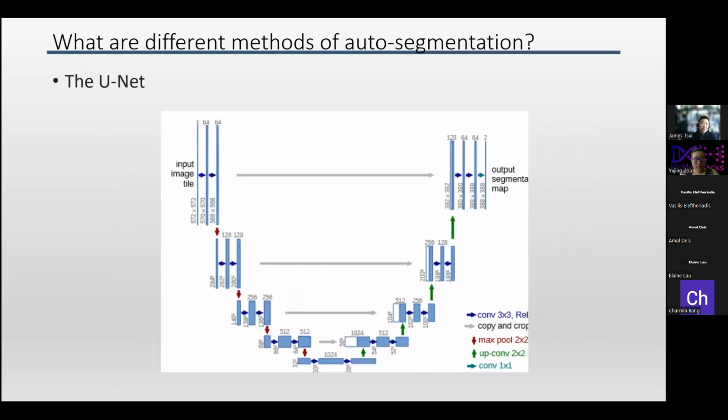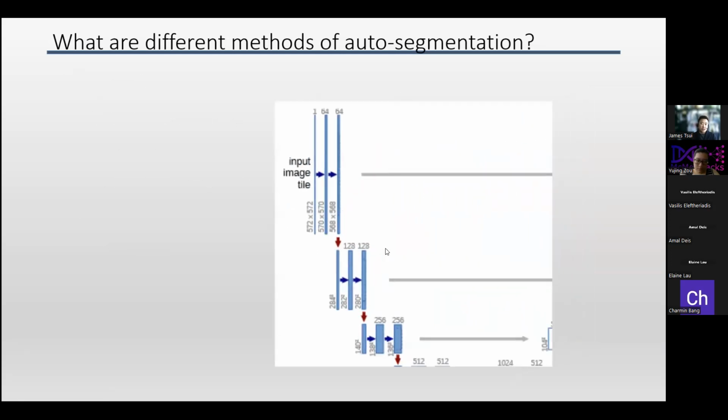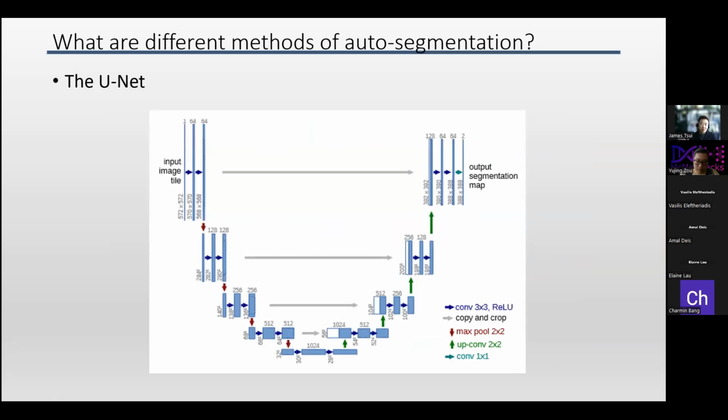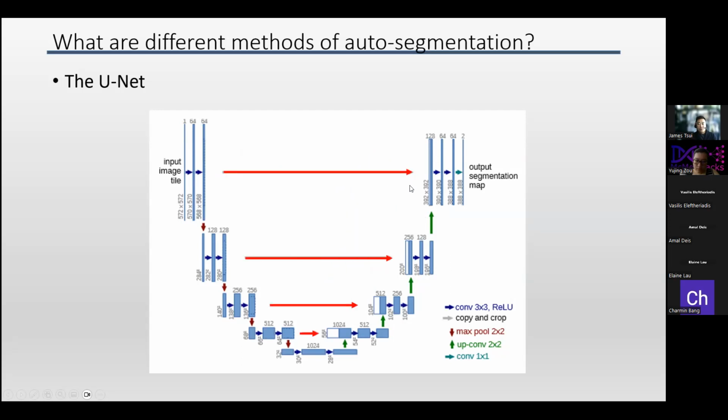So I thought that was an interesting side point for you to understand the power of a deep learning neural network. Okay, going back to the U-Net, basically these low-level features are then passed into the second layer of the convolutional neural network. The size of the input image drops down by a factor of 2, while the channels increase by a factor of 2. So you have more and more features integrating information from more distant pixels in the image. You continue this process. You go to the bottleneck layer, which contains a rich deep learning embedding or data representation of the input image. Then you feed it back into the decoder. There's also a skip connection, for 2 reasons. Originally it was thought that by feeding the skip connection, it gives spatial information so that the decoder can have more contextual information. There are some who believe that it actually helps with the training, like a ResNet or a DenseNet.